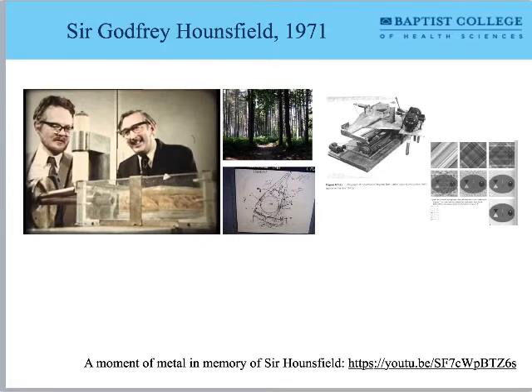Hounsfield got this idea. This is him smiling and looking at a cow brain here. While he was walking around Sherwood Forest, like Robin Hood country. He grew up in Nottinghamshire, was walking around the forest one day and had that great idea: what happens if you swing rocks around your head while you're banging them together? And CT was born. So that's an illustration of the first prototype CT scanner. And you can see right here, this is literally just a record turntable. It's a lathe.